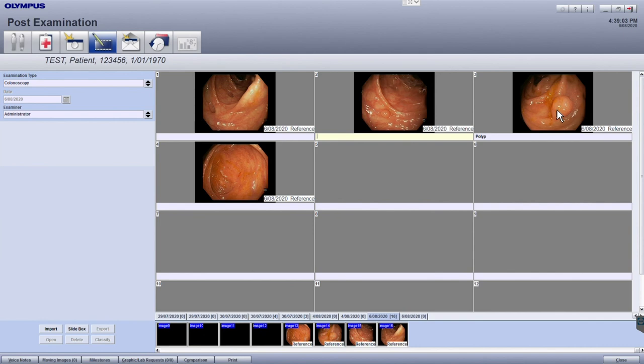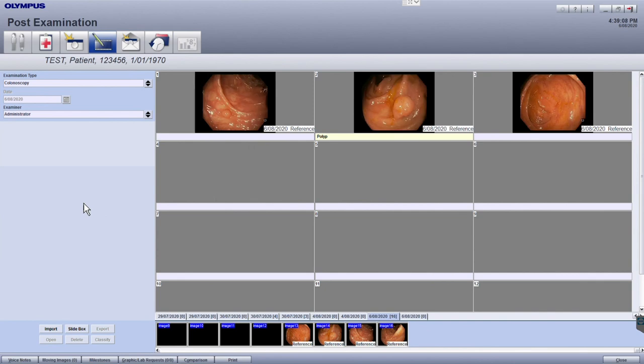To remove a selected image, drag and drop the image outside of the grey box.